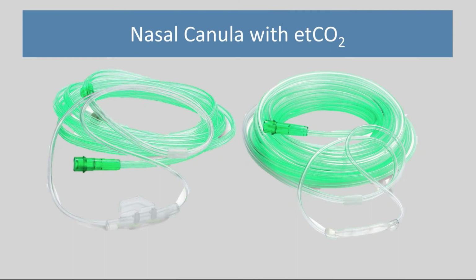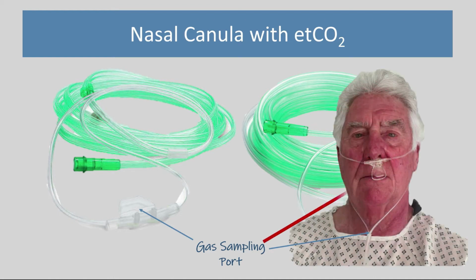Due to a series of sentinel events in the early 2000s, these days it is considered standard of care to measure end-tidal CO2 in patients who are sedated, and this can be achieved with modified nasal cannulae. These are a couple of examples. You can see here these are gas sampling ports that are located just below the specs, and they measure carbon dioxide as it's exhaled from the mouth. So the device just kind of sits on top of the mouth.